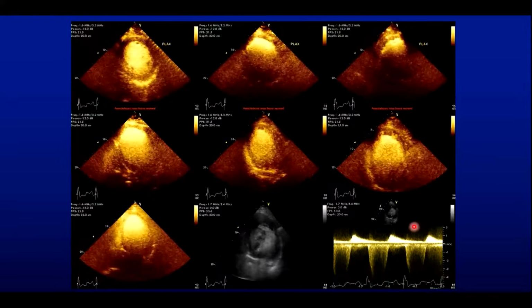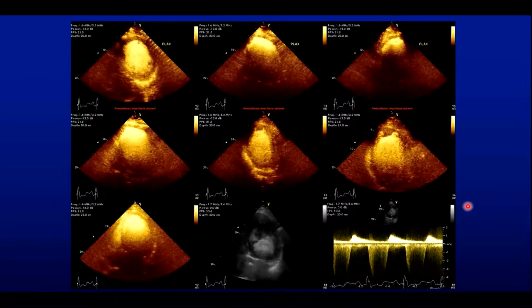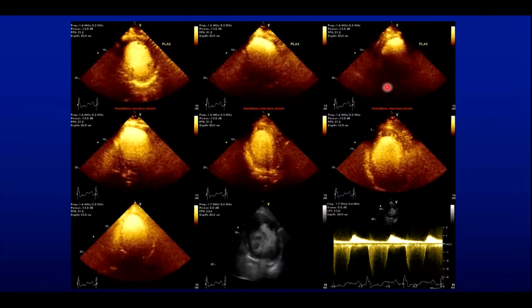Okay. So, having gone through the basics of contrast, in this image there are two situations we talked about, and can you tell them to me? Top right, there's a lot of contrast. So we have a lot of contrast. Nowadays we dilute it, although the package insert doesn't tell you anything about dilution, but you will avoid such a situation, or you inject very slowly and dilute it. So you have attenuation, you have too much contrast. So that's one.